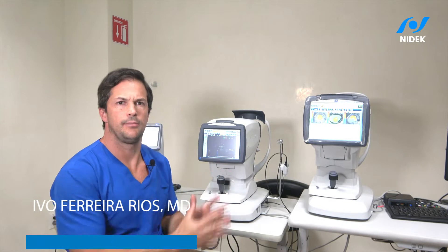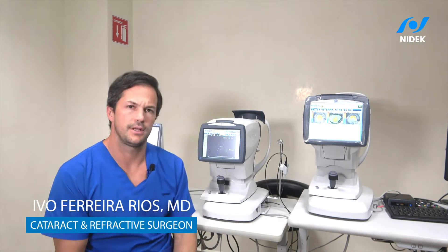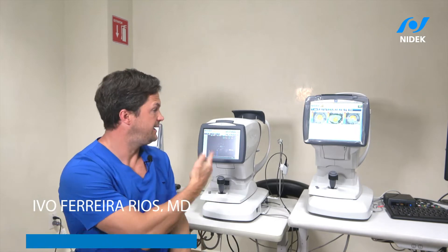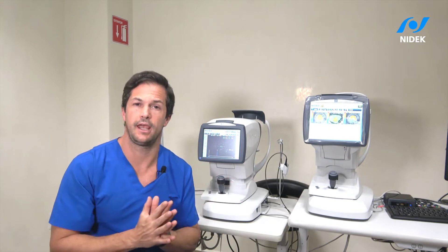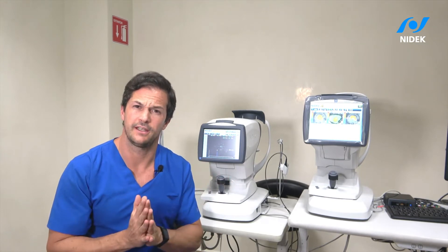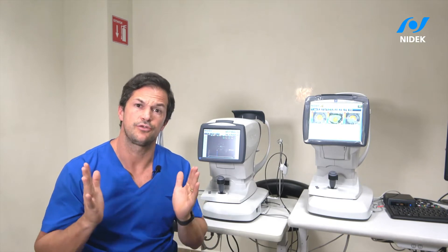It's a pleasure to talk about such an amazing device. The Allscan is an optical biometer — I already did an exam right now and it took me 45 seconds. I can do it again. The good thing about this is anybody can use it. It's easy to use and reliable.